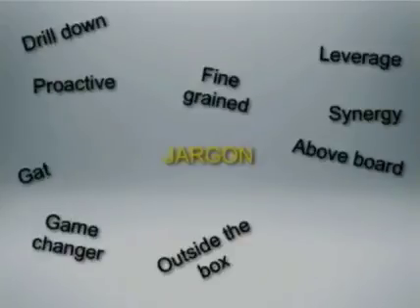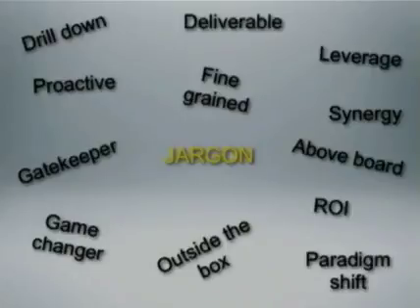I'm going to start off my presentation with an apology, which is unusual for me, but I'm apologizing for all the jargon in the title of my talk. We see jargon in every facet of our lives these days. It's impossible to escape it. But I felt that the use of some jargon in my topic title was warranted, and I'm going to explain that to you.